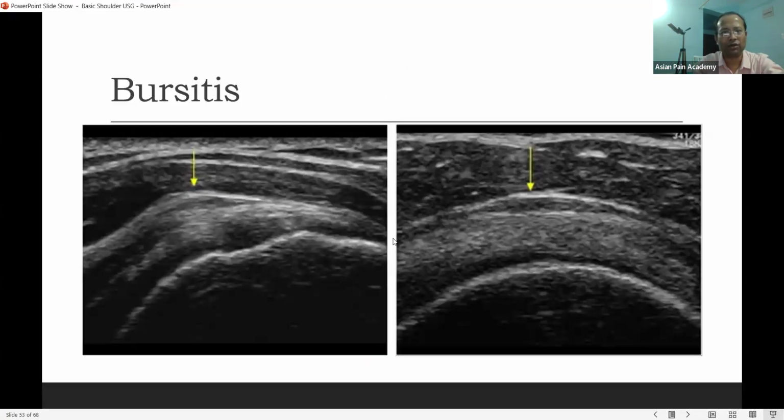SASD bursa, I told you that it is the black line within that white line. First identify the two muscle layers, layer 1 and layer 2. Then in between is the white line, that is the loose areolar tissue area. Then the white line, black line between this white line. Okay, so if there is bursitis, there will be fluid collection. So this much fluid collection is abnormal, because today on the volunteer you have seen that it is very difficult to identify even.